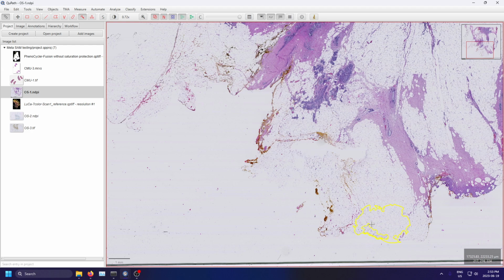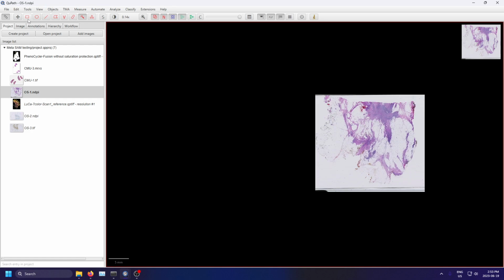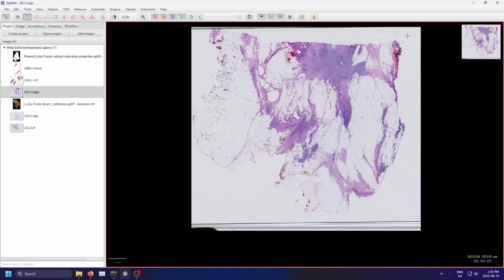So, yeah, I think this is a great example where the robustness of SAM and the diversity of its training data is a great asset to have in something like QuPath. If you wanted to, say, label a tissue section, it's not going to be perfect, but you can always modify annotations using a combination of other tools. So in this case, I'm showing an example of filling in some parts of a missing annotation.